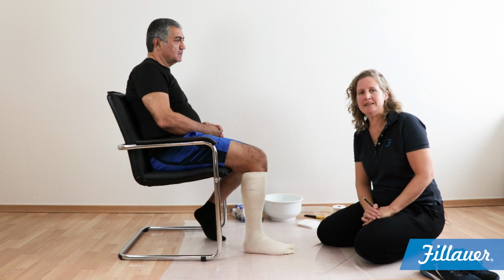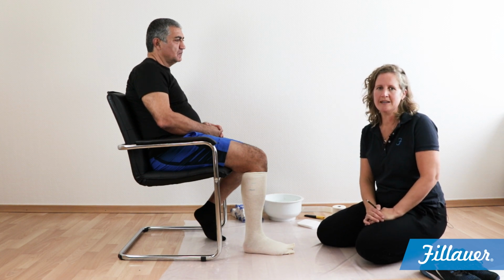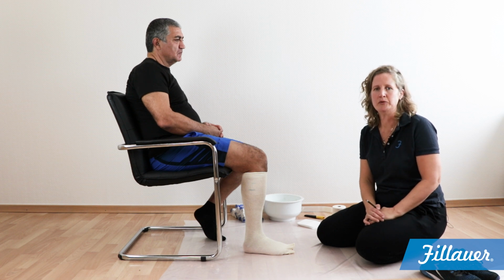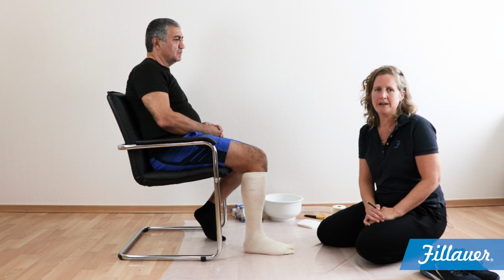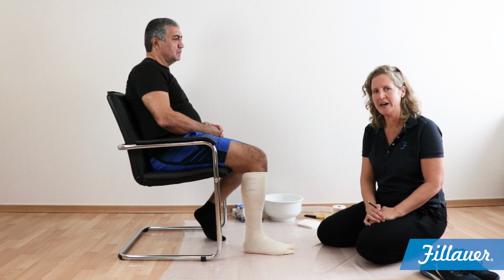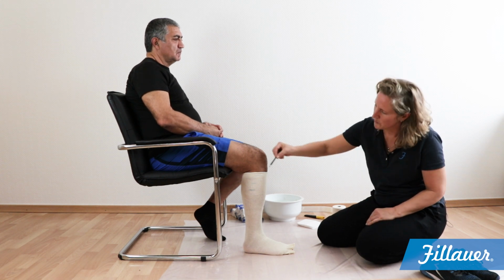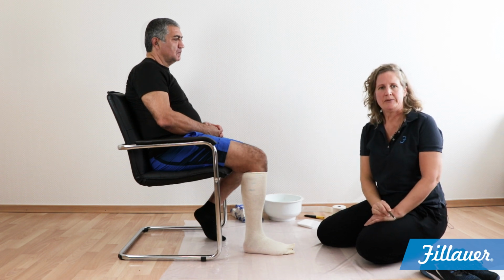The cast should be done in the seated position with only the weight of the leg on the foot. This will make it easier to achieve a neutral alignment, as well as make a cast that will be easier to fabricate the foot plate on. You need to cast the entire leg, the foot and the calf, and about 5 centimeters higher, so around here. This is important for fabrication.